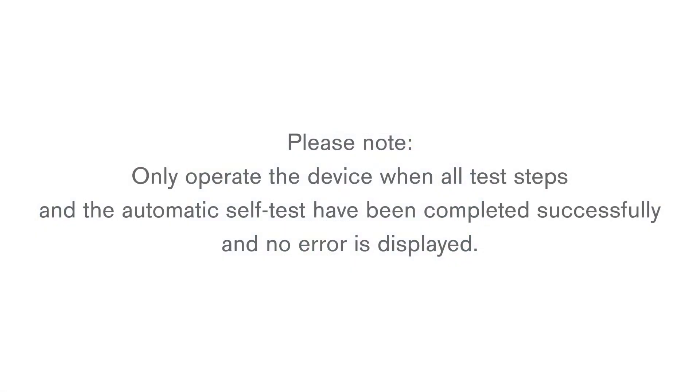Please note: only operate the device when all test steps and the automatic self-test have been completed successfully and no error is displayed.